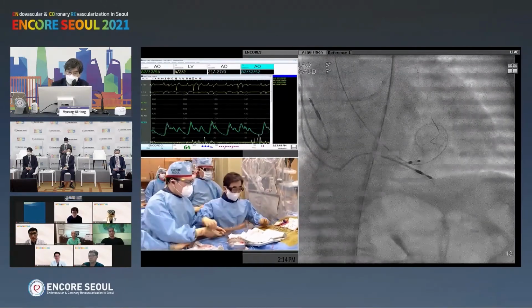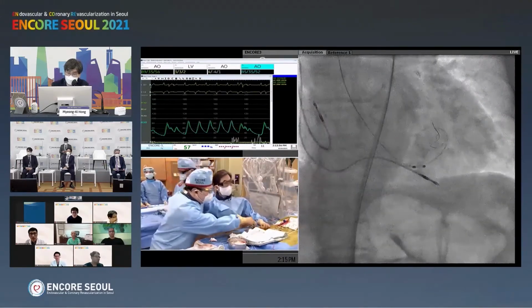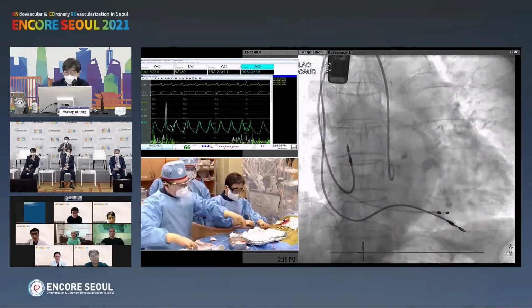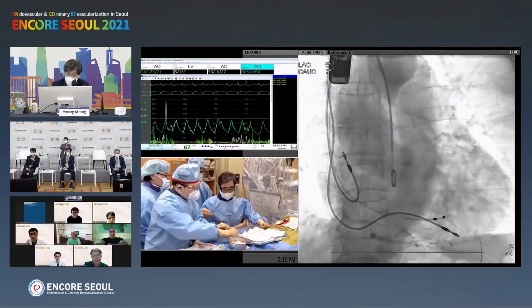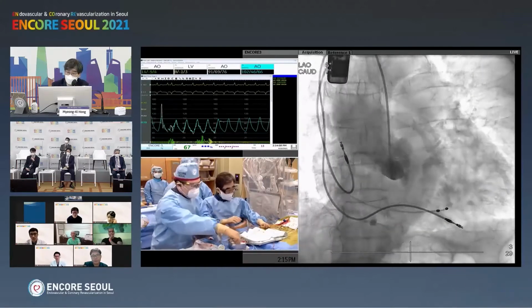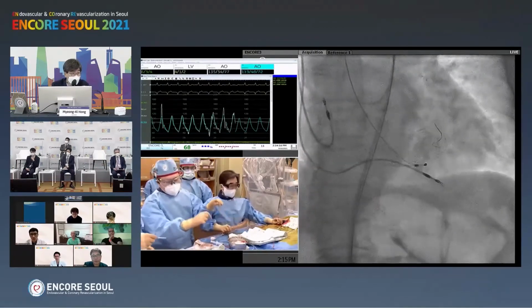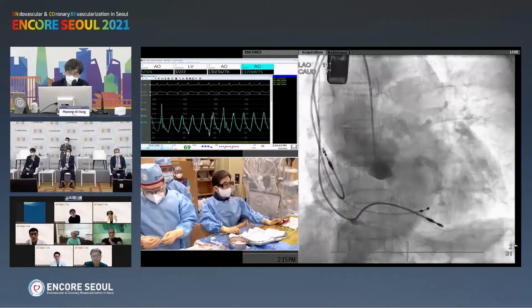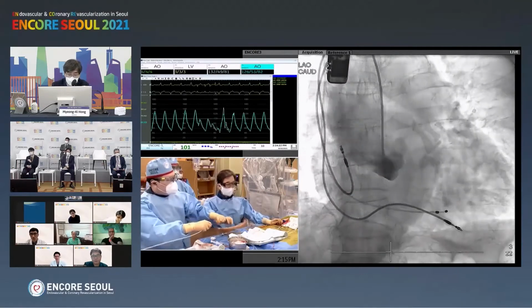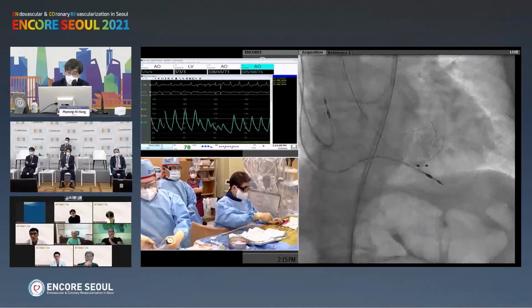This is a high risk of coronary occlusion by the small sinus of Valsalva, less than 30, and the low coronary height. So Dr. Kim, coronary protection with guiding catheter with balloon and wire, and then second step is a check of the possibility of coronary obstruction with a predilation is the adequate treatment strategy. The disadvantage of it is actually this patient has diabetes and chronic renal disease, so there is a possibility of using more contrast.